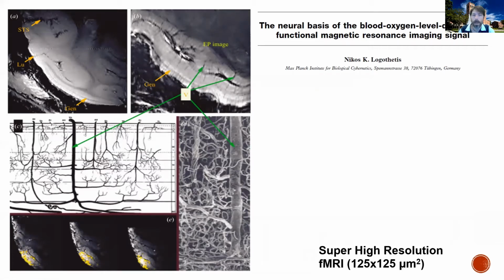Indeed, if you use a different imaging technique, you can see that these lines right here, for example, this one, is this. So now you can really see how blood vessels are playing a key role in MRI, because these big colors that we see changing are blood vessels and the tissue surrounding the blood vessels.